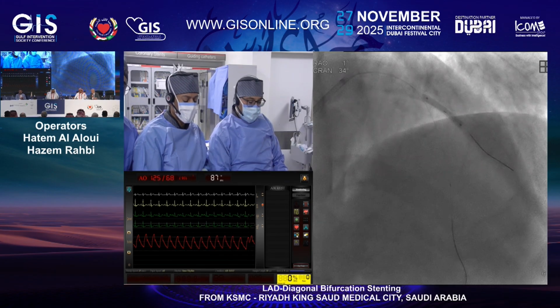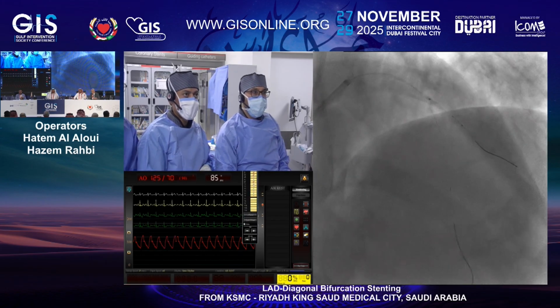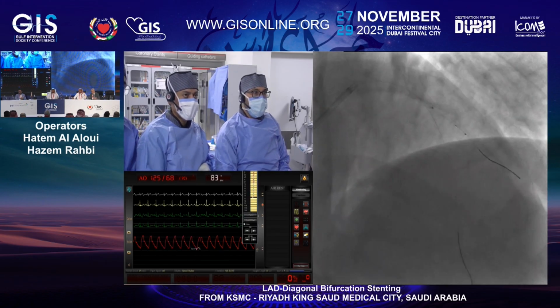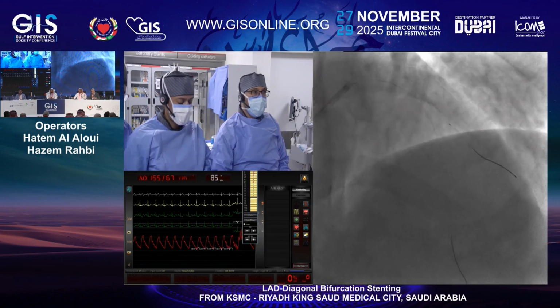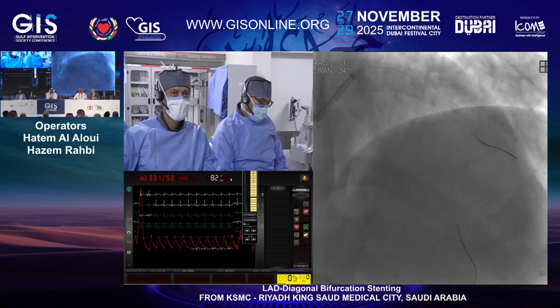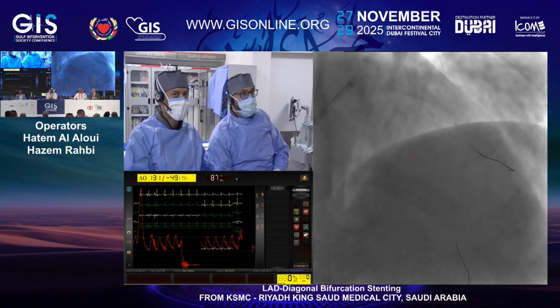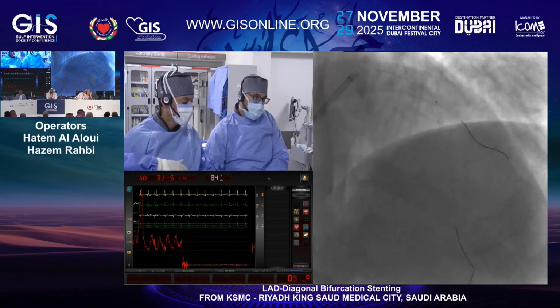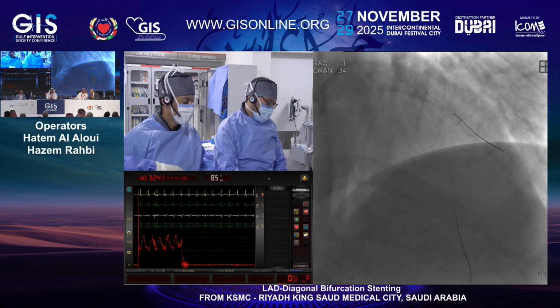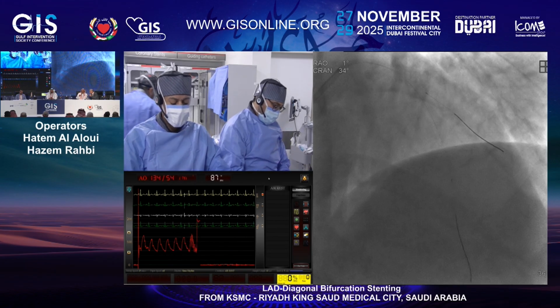He starts having some ST elevation. You see the relevance of this diagonal branch, actually. Nitro.